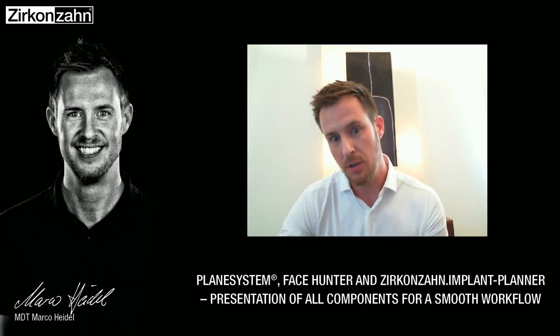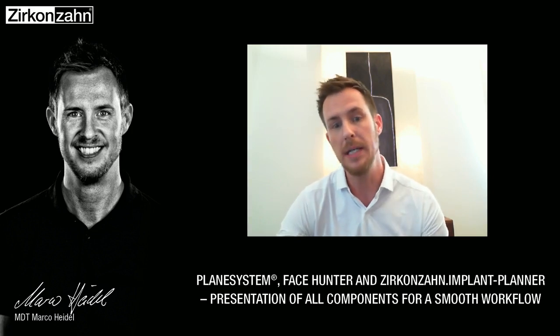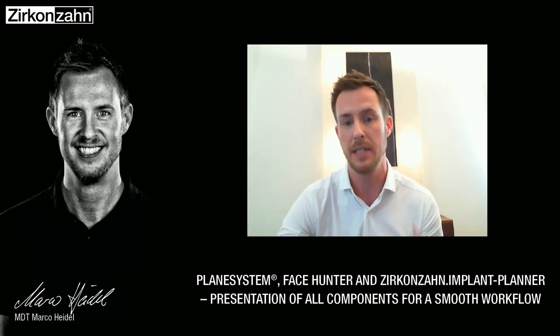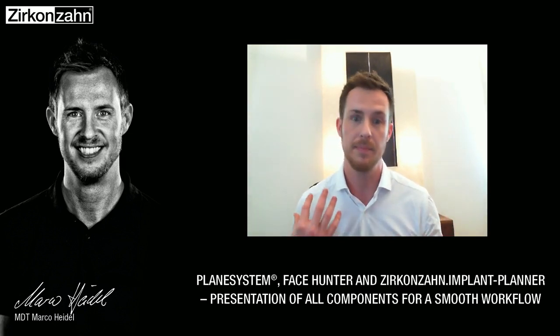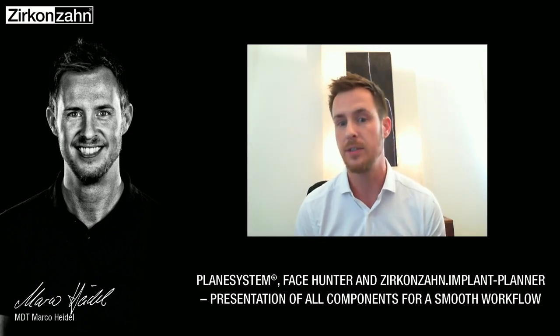But what I want to show here is that the whole tooth area is monolithic. There are no reductions, no space for porcelain. So I keep it as it is and use it as a monolithic restoration. I just put a little bit of porcelain at the gingiva area, and the teeth area is just staying in glaze.